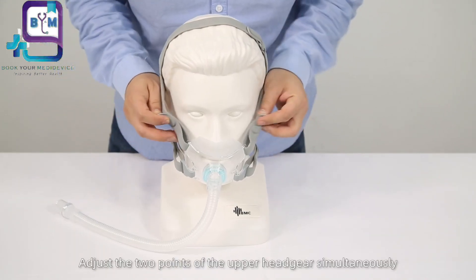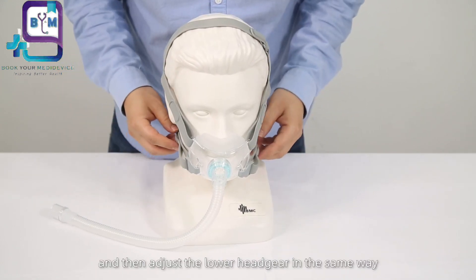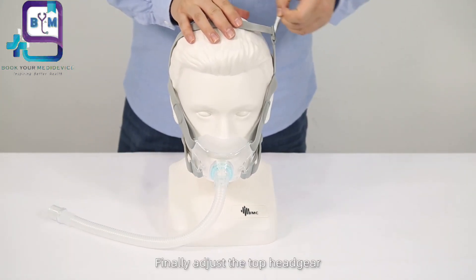Adjust the two points of the upper headgear simultaneously, and then adjust the lower headgear in the same way. Finally, adjust the top headgear.